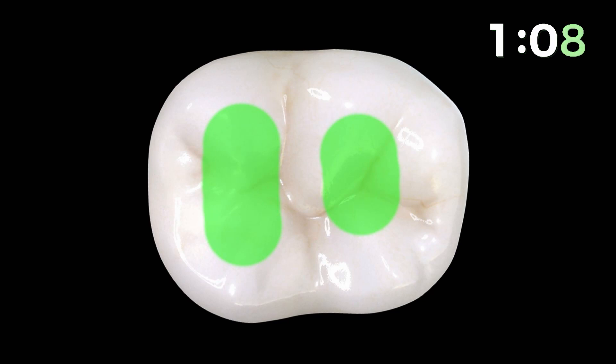In case of a mandibular molar, the mesio buccal and mesio lingual canals could be prepared with a single preparation, and the distal canal could be prepared as a single preparation, thus leaving intact tooth structure in between.